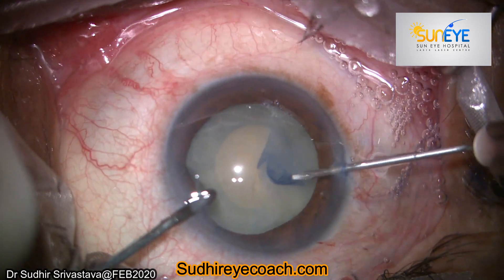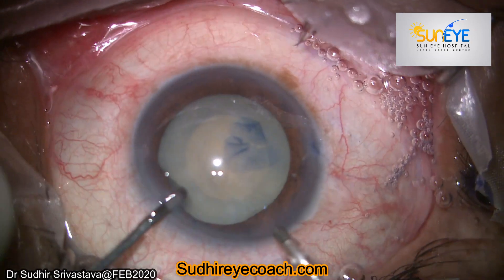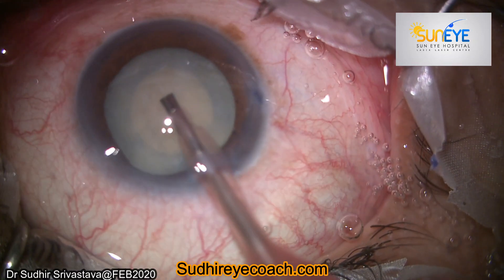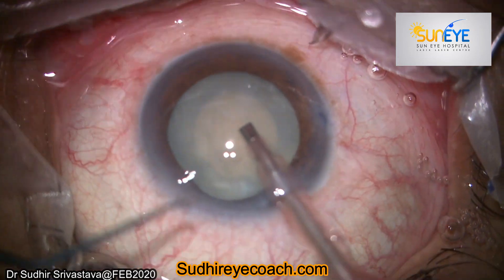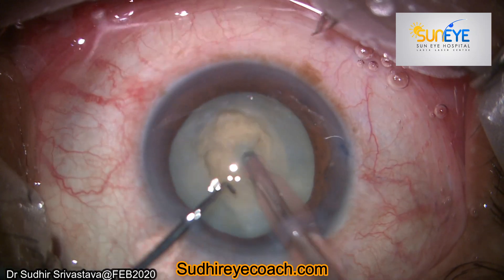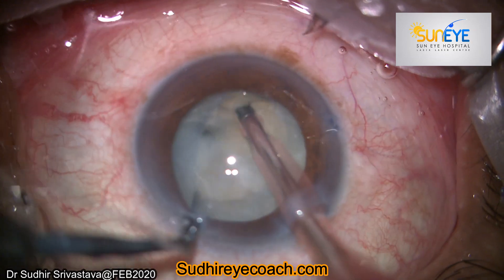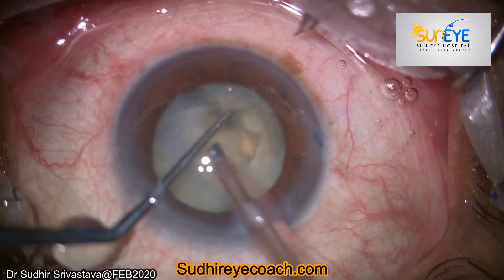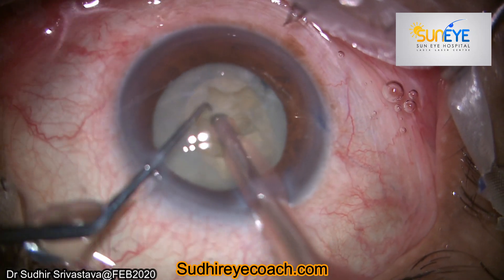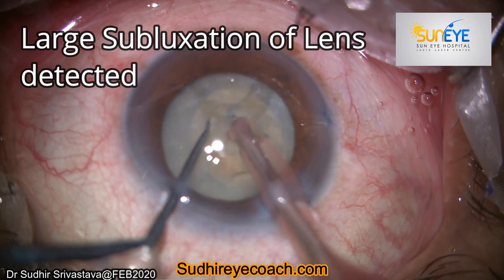I started making my capsulorhexis and deliberately made around 5.5 millimeter capsular axis. Then I started my phaco fragmentation. Normally I prefer to do vertical chopping — I prepared the bed, buried the phaco tip, and started my chopping. At this stage everything was going as per my expectation. I rotated the nucleus again and held the nucleus with the phaco tip and again chopped the nucleus.